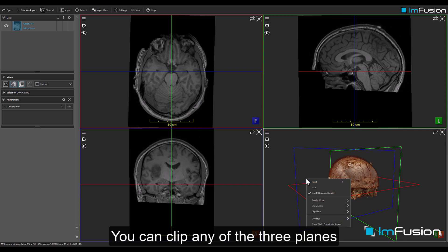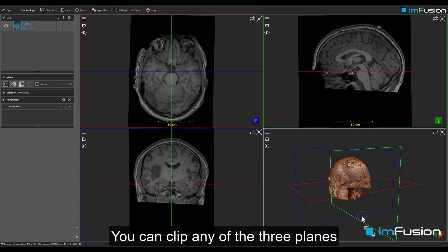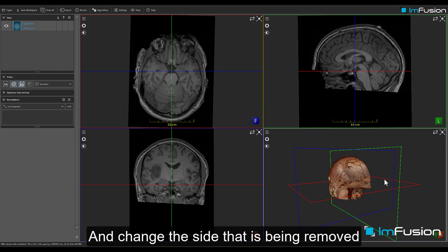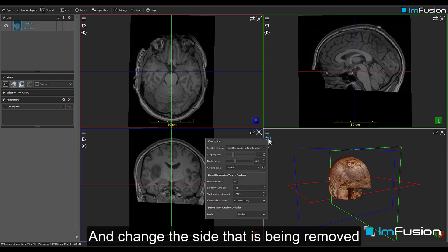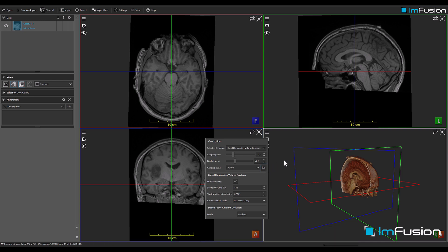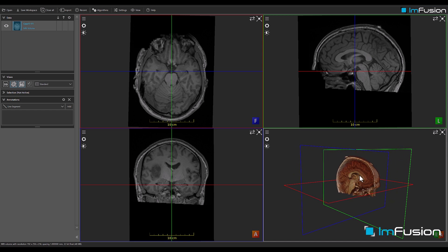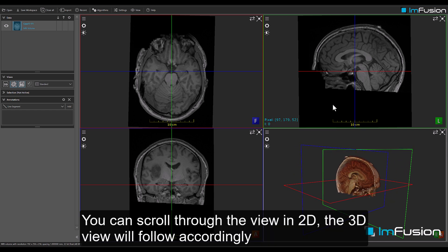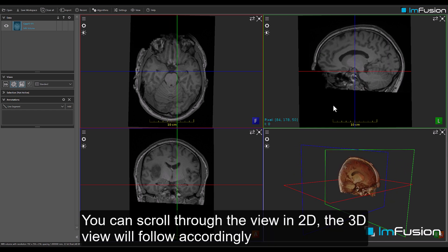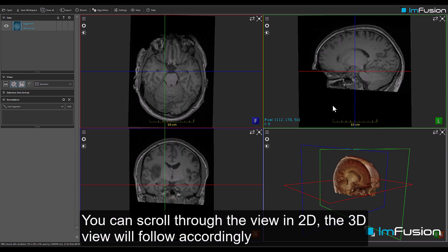You can clip any of the 3 planes and change the side that is being removed. You can scroll through the view in 2D, and the 3D view will follow accordingly.